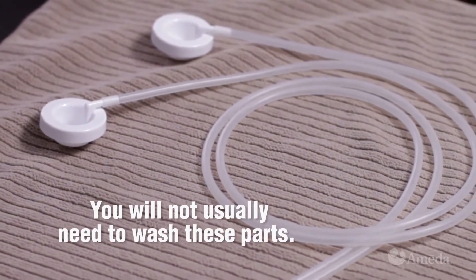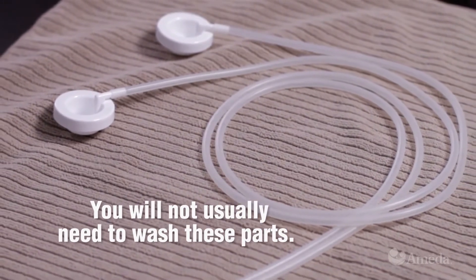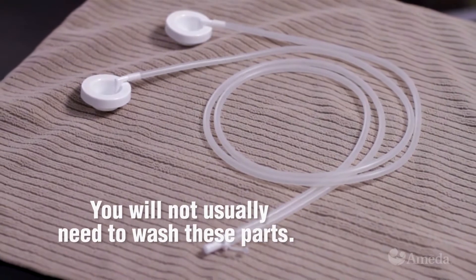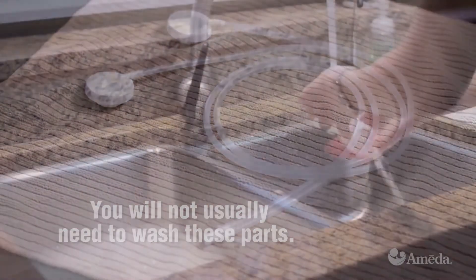The tubing, adapter cap, and tubing adapter will not usually need to be washed because the silicone diaphragm prevents them from coming into contact with your milk.